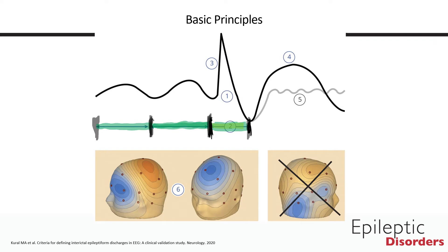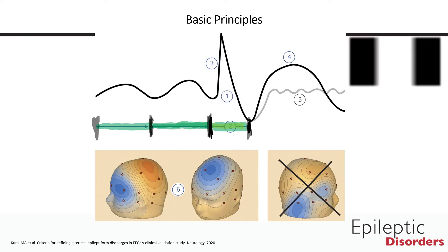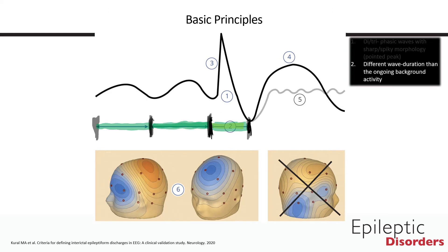The second criterion is looking for the duration of the waveform. As you can see, outlined by the green below the sharp wave, the duration of the epileptiform discharge is shorter, i.e., different, in comparison to the duration of the waveforms that preceded. This fulfills criterion number two.